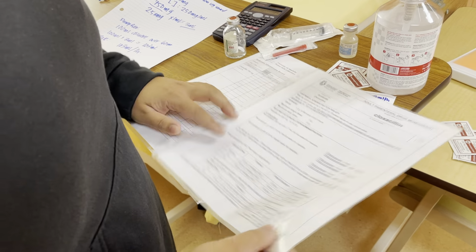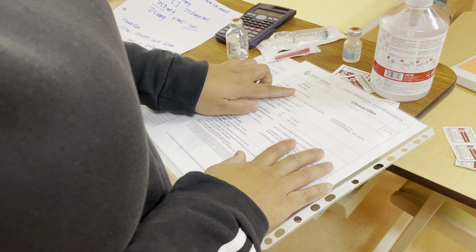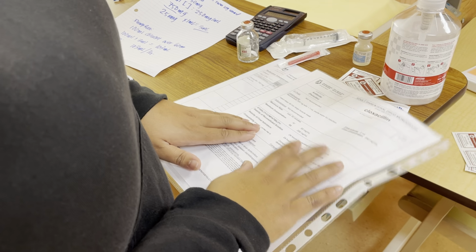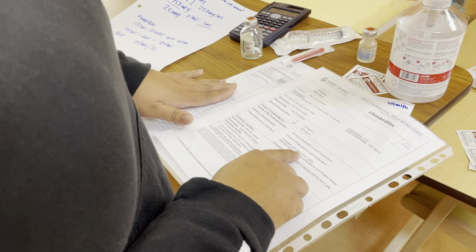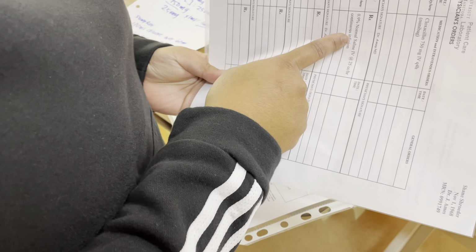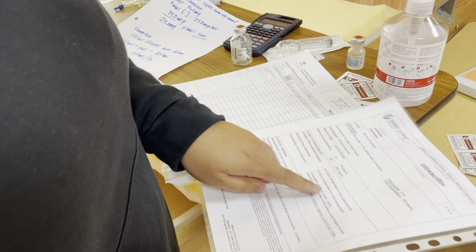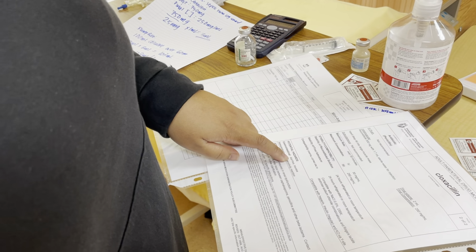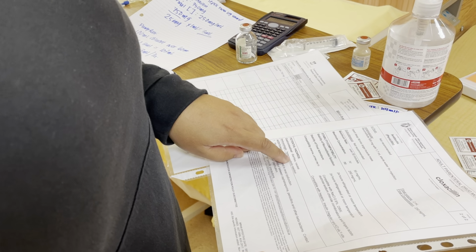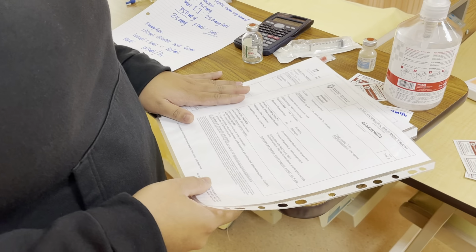And then I'll also look at the compatibility. It's compatible with normal saline, and my patient is currently running normal saline as a primary, so that's compatible. And then I'm looking at the potential hazards. So diarrhea, nausea, and allergic reaction is what I'll be monitoring my patient for.